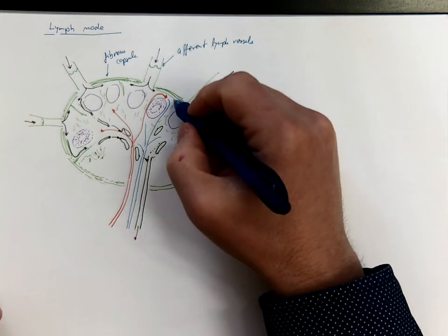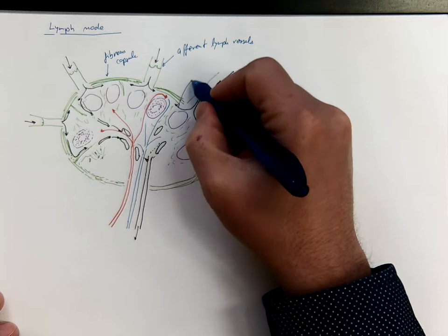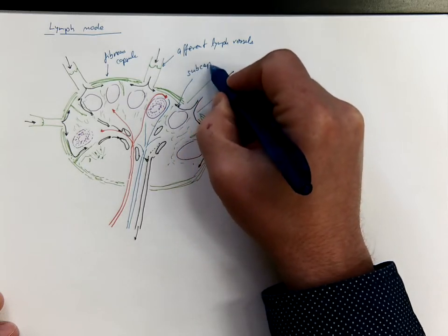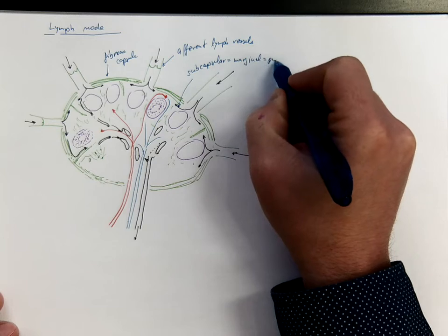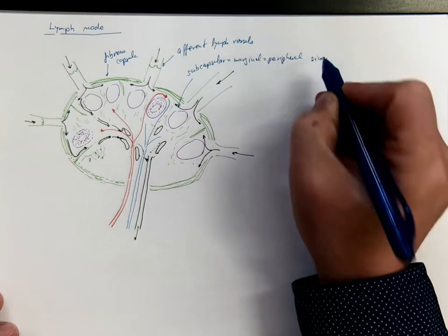And this subcapsular or marginal sinus, or peripheral sinus.